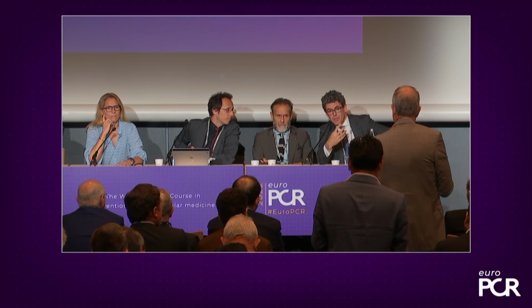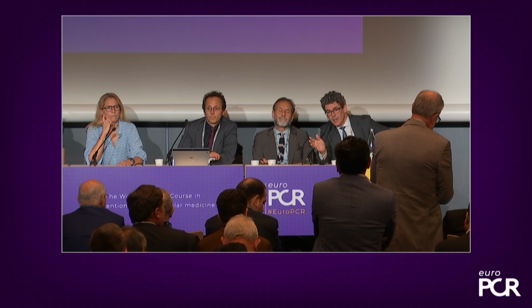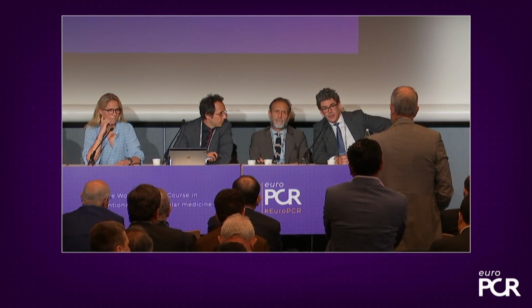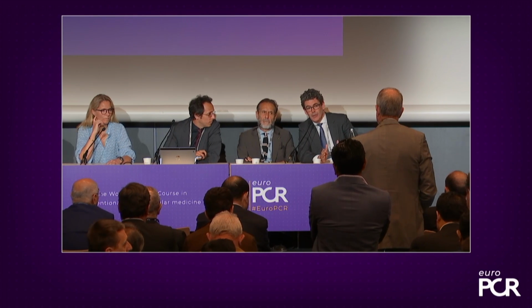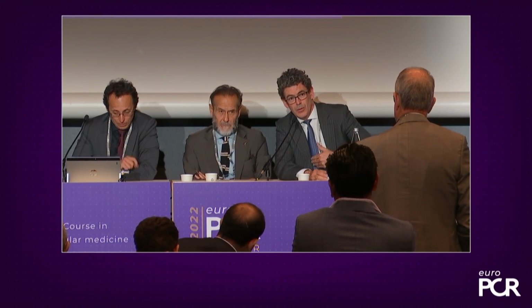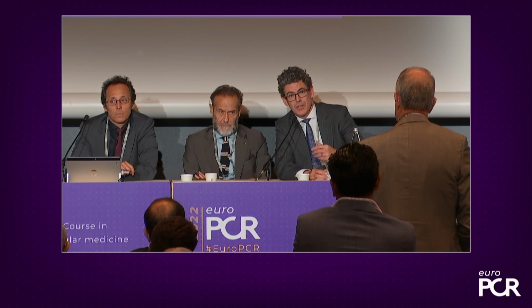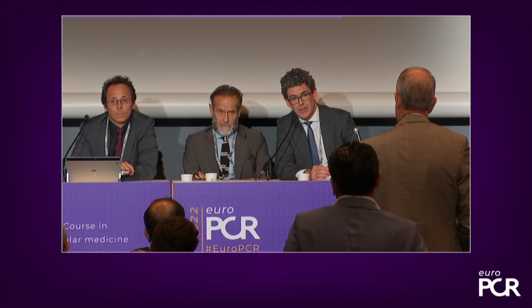I think the OCT data supports giving as many shocks as possible, and we saw the numbers of shocks that were given in the CAD series of studies. So I think you have to divide your thinking into the focal modification, where you can achieve a full expansion, and the deep wall calcification that we see along the length of the lesion, which affects the vessel compliance.